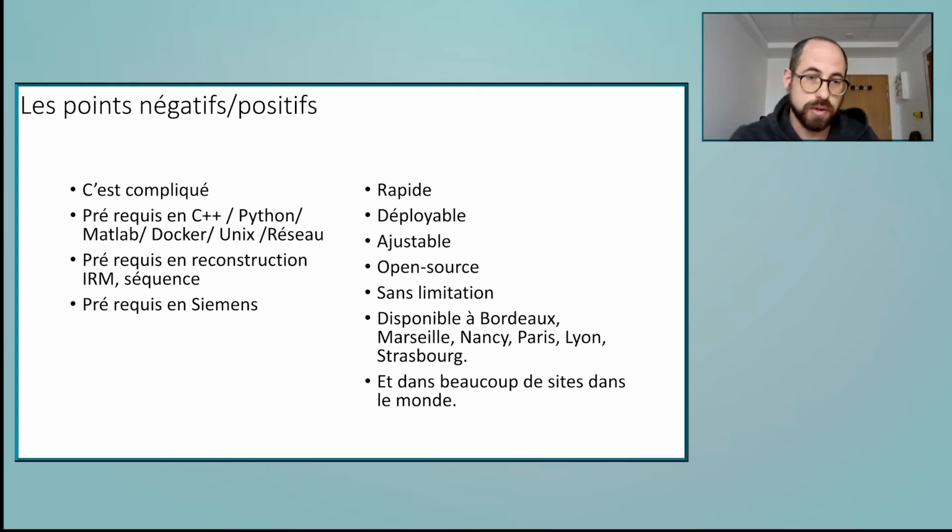And you also need to understand how the sequences are set and how the data are organized when you are generating the k-space. And because most of us in France and Switzerland are working with Siemens, I think, in this call, you also need to understand the Siemens logic. This is a bit difficult at the beginning, so don't hesitate to ask for help at any moment if you want to start.